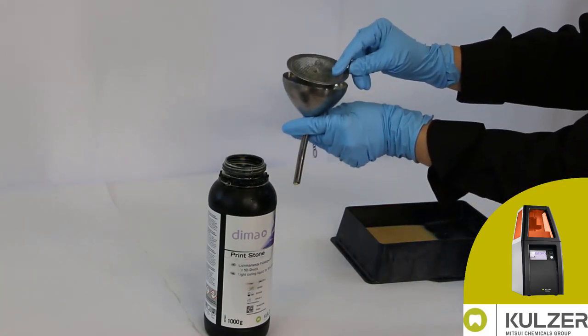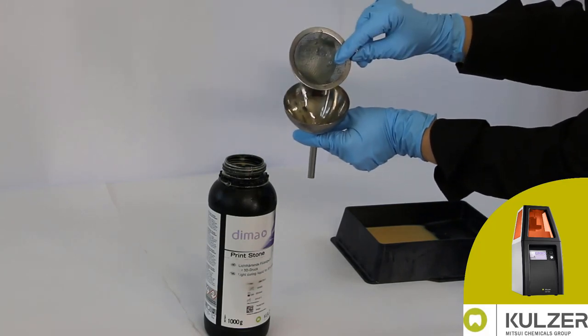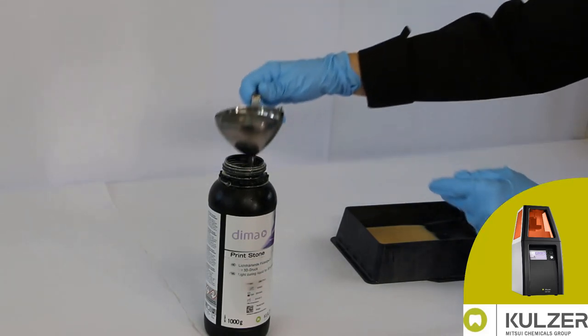During printing, it is important to filter the photopolymer when filling it back. Insert the steel funnel with the attached strainer into the bottle.